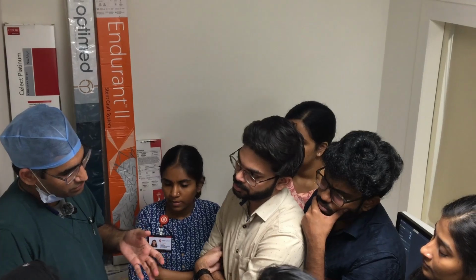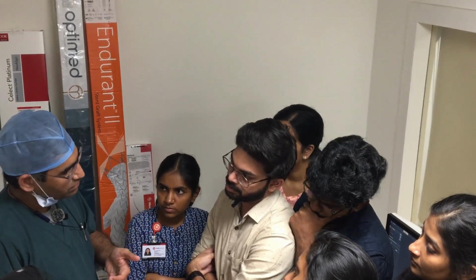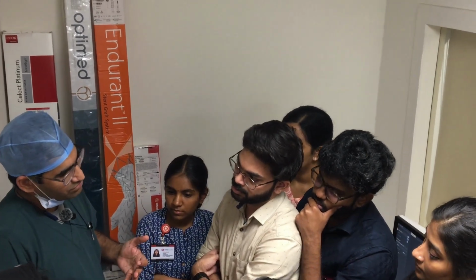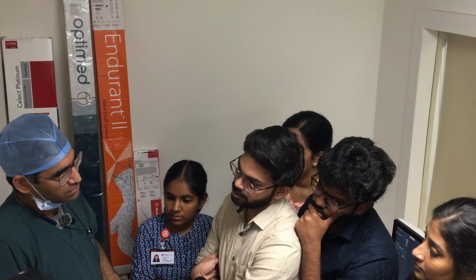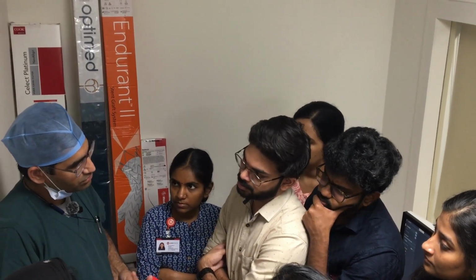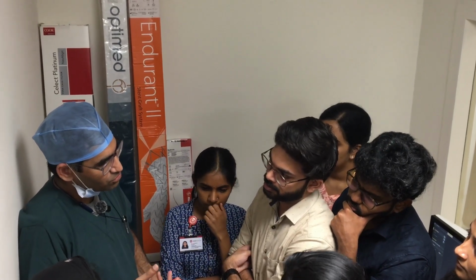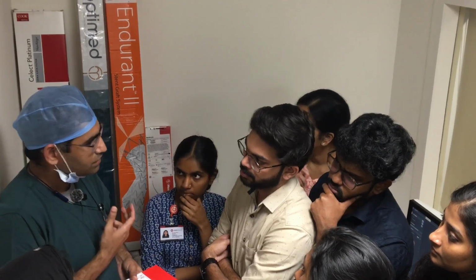Why is it important when we are dilating a tough lesion? The balloon should not rupture, so we have to make the balloon tougher if we are dealing with a tougher lesion. If you are using a balloon just to remodel something, you don't need that much. There we use softer balloons.